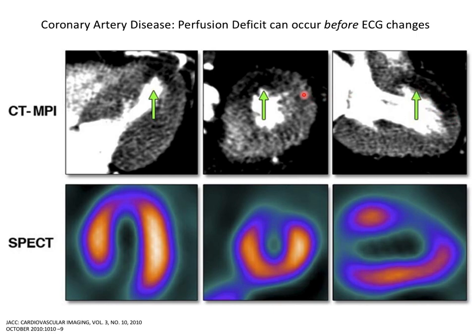Very rarely do you see it this clearly. This is just a slam dunk shot of a perfusion deficit. More than likely, this is a very big perfusion deficit. The vessel that's causing this is probably shut, completely closed.